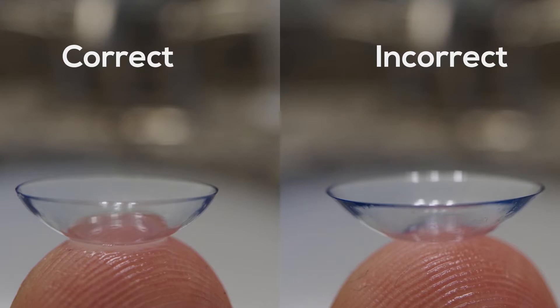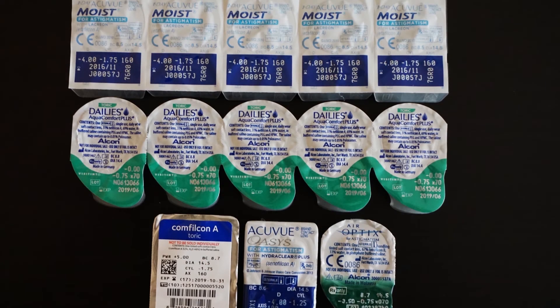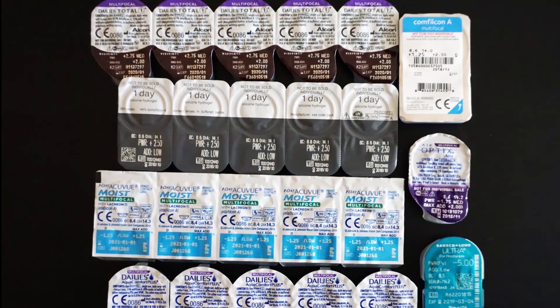Things to remember: If a contact lens is irritating your eye after putting it in, take it out and make sure it's not inside out or defected. Also, keep in mind that astigmatism and multifocal contact lenses often take a couple minutes to settle for clear, comfortable vision.